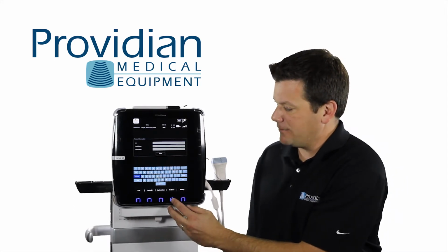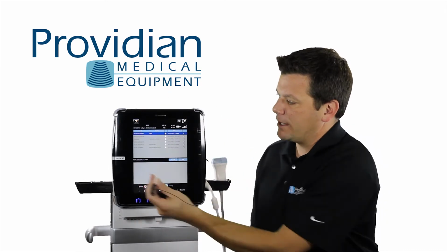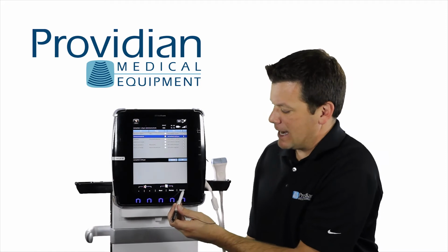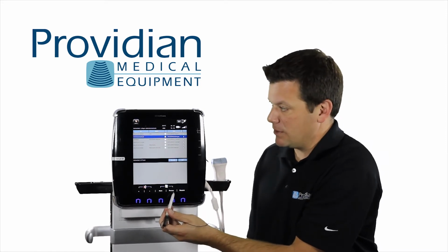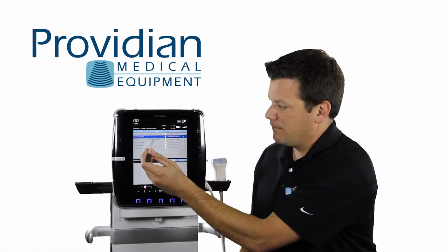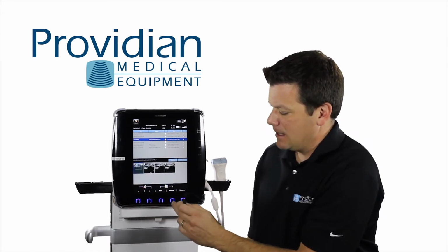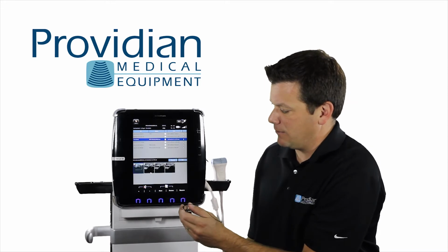We have our archive, where I can show previous patient information. I can select that patient, and I can resume the patient. I can review the images with that patient. Currently, if I go here to this, I can see the images that I took in a previous exam. I can review those images by pressing review.